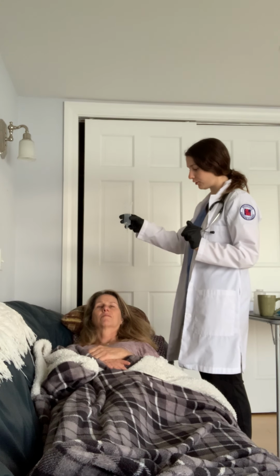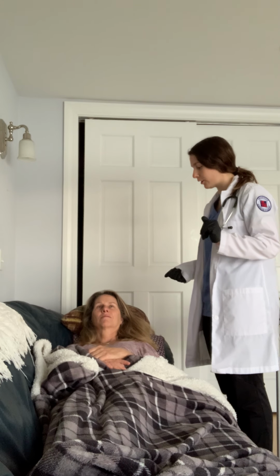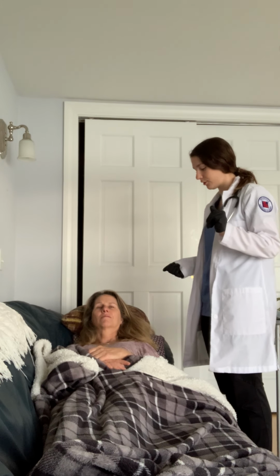And I would also want to flush again with water after the feeding and make sure that the head of the bed is elevated at least 30 degrees during the feeding and 30 minutes after. I would then make sure to provide frequent mouth care for my patient to decrease the amount of discomfort that she feels from her tube. And now I'm ready for the actual feeding. I'm going to go get my supplies and leave the patient with the call bell in reach. And do you need anything else before I go grab the supplies? No, thank you. Okay.